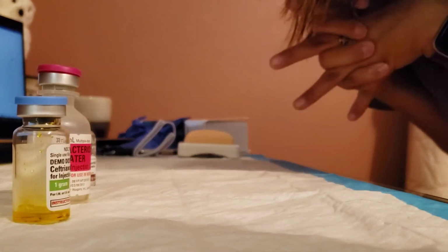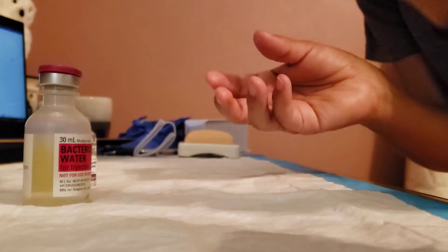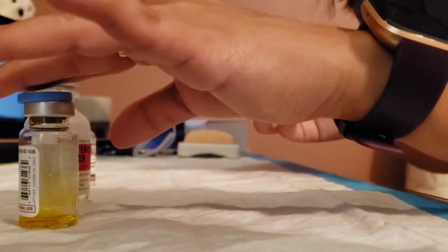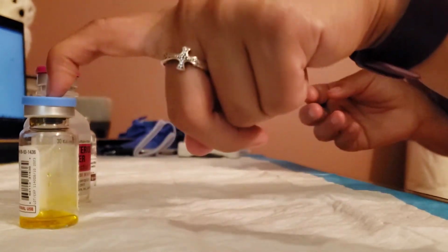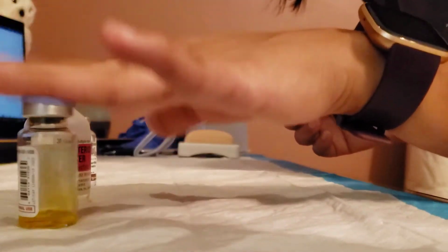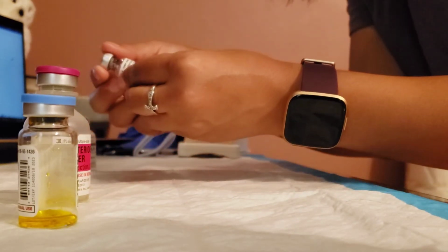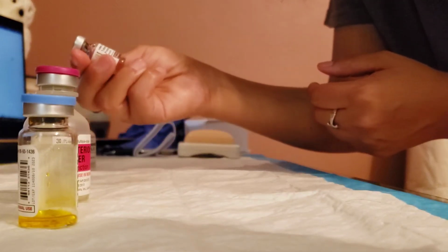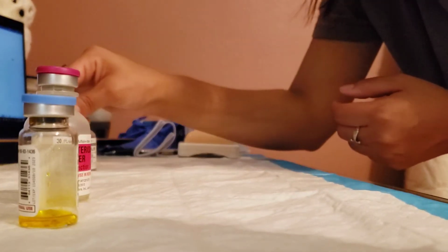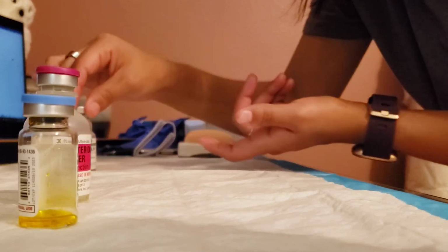So I need ceftriaxone 1 gram for infection, and my vial is ceftriaxone with 1 gram in here, so I'm going to leave that alone and use all of it. I'm going to add my 2.5 ml to that and pull out my 2.5 with my gram in there, so that's good. I have my TB PPD here. There's about 1 ml in here, so all I need to do is draw up my 0.1 ml. Then I have my NPH insulin, and there's about 100 units in here, and all I need is 12 of that.